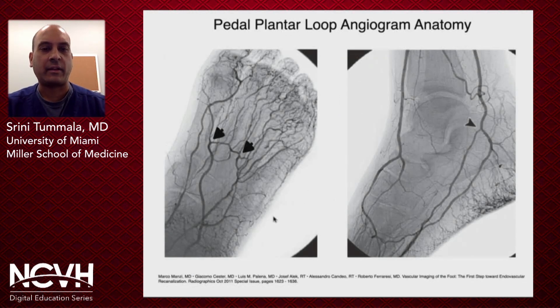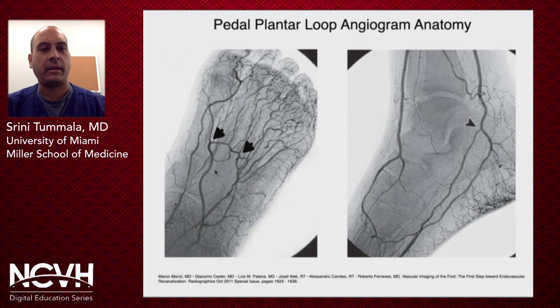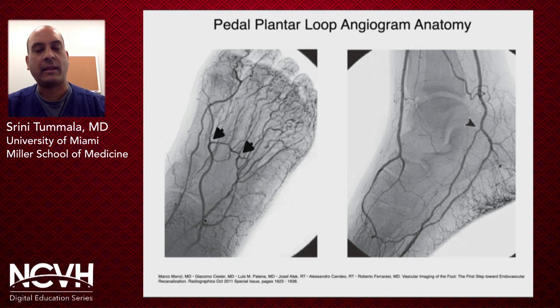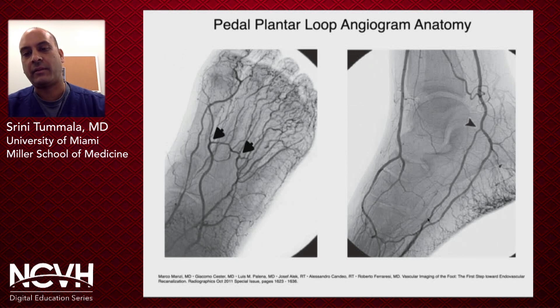Here are a couple of angiograms from a normal patient who had really no abnormality in their pedal plantar loop. You can see at the base of the first and second metatarsal, here's the dorsalis pedis artery making its first turn into the deep perforating artery, and then near the base of the third or fourth, it's making its next turn into the lateral plantar artery. With an optimized lateral foot x-ray with the base of the fifth metatarsal, drawing a line through the base of the metatarsals should intersect the base of the fifth to open up the bifurcation of the common plantar artery.